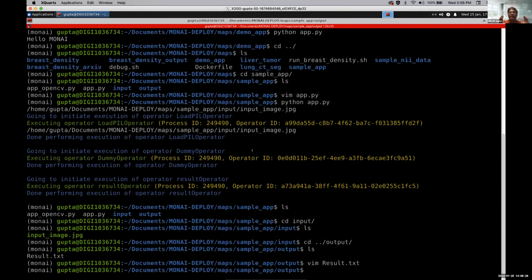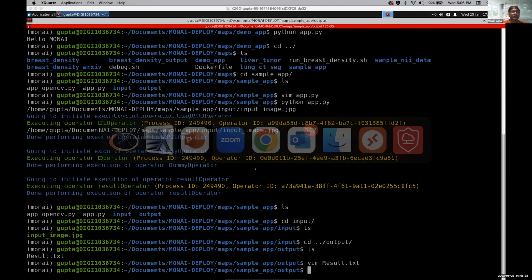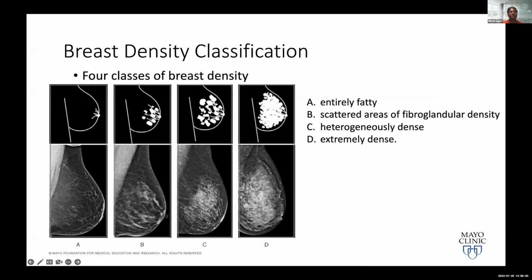So yeah, that's a very simple example to convince you that you don't have to think only in terms of deep learning. Now let's get back to more complicated stuff now that we talked about it. You saw a segmentation example by Tom. And as you know, most of the problems in radiology are either segmentation, classification, or detection. So I'm going to show you a classification example.